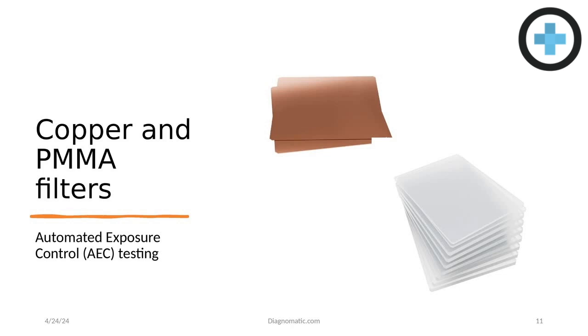PMMA filters, or polymethyl methacrylate filters, provide a standardized thickness and composition, ensuring consistency of these test conditions. These have a similar density to human tissue, and when placed in the X-ray beam, these filters mimic the absorption and scattering of X-rays that occur in actual human tissue. So it provides a realistic test scenario for these AEC systems.